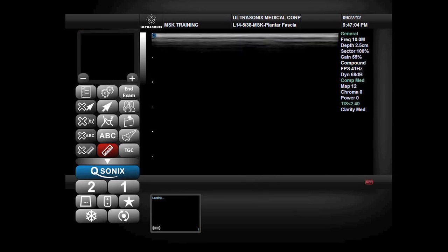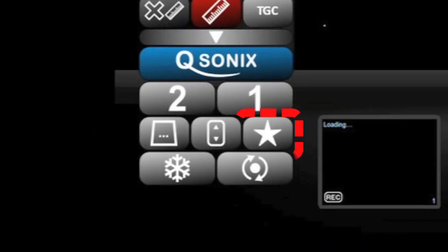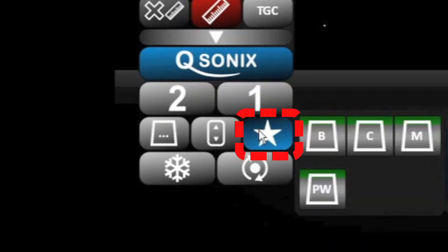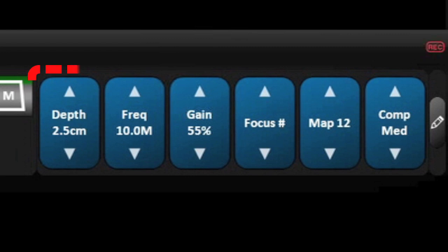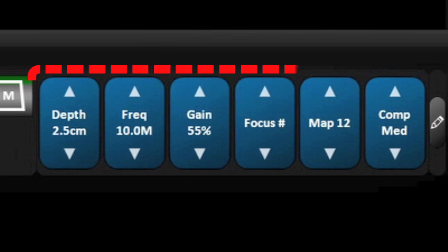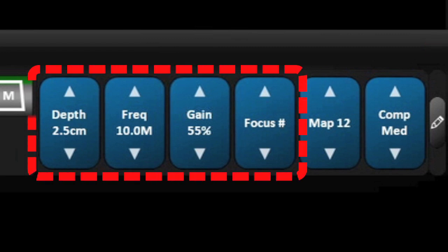Further changes to the image can be done by opening the favorites drawer to make changes to the depth, the frequency, the overall gain, and the number of focal points.